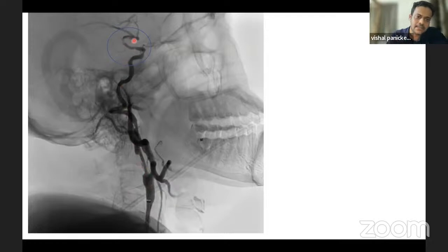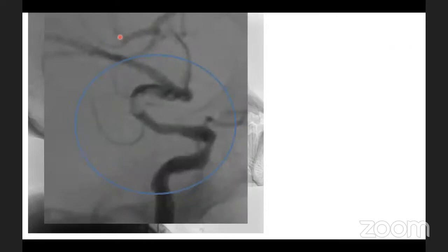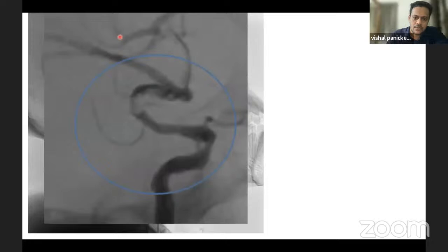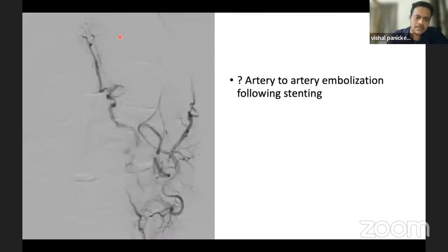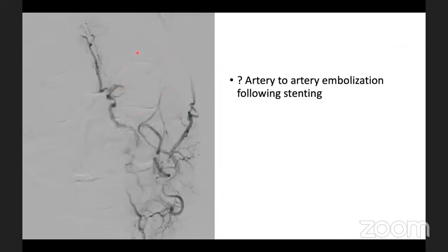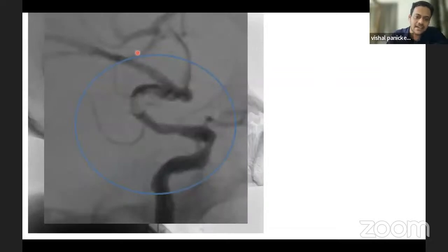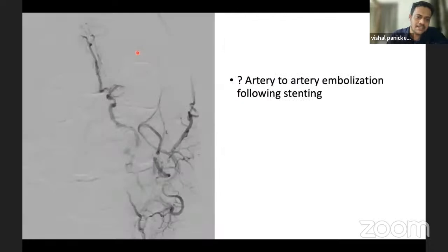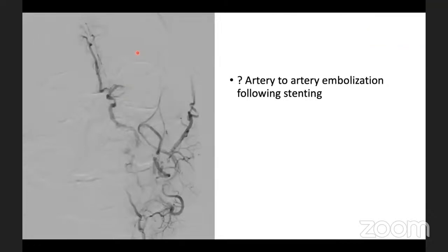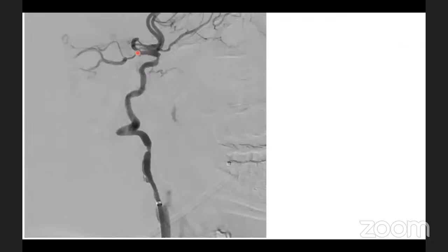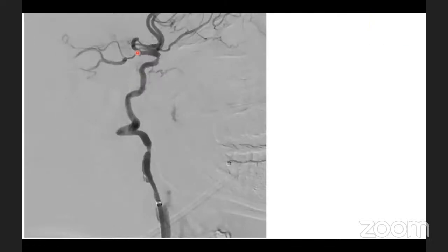After the angioplasty shoot, the M1 became completely occluded — distal embolization of the clot had occurred after the contrast injection. The faculty warns that when injecting with full force in a stenotic artery during the procedure, you are throwing the clot distally. In a nearly occluded ICA, there is no flow, so embolus won't travel upward unless you inject repeatedly. Therefore, fewer angiographic runs during the procedure are advised.